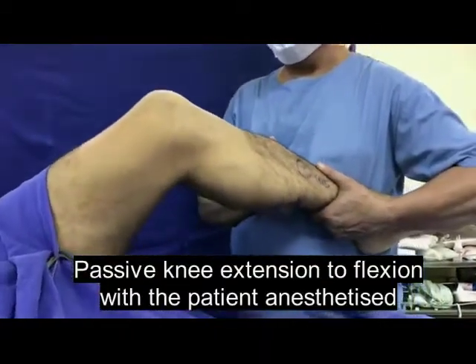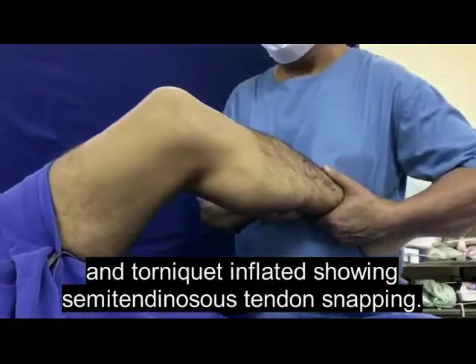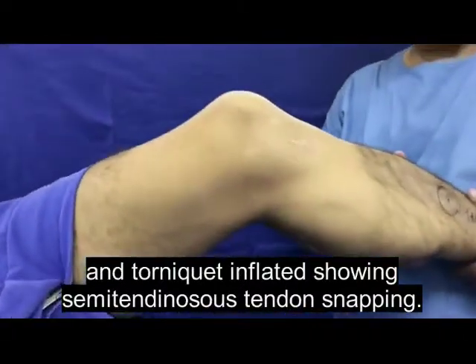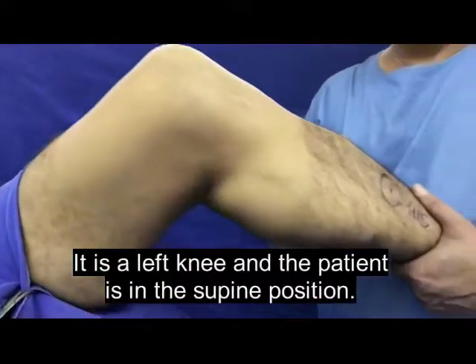Passive knee extension to flexion with a patient anesthetized and tourniquet inflated, showing semitendinosus tendon snapping. It is a left knee and the patient is in the supine position.